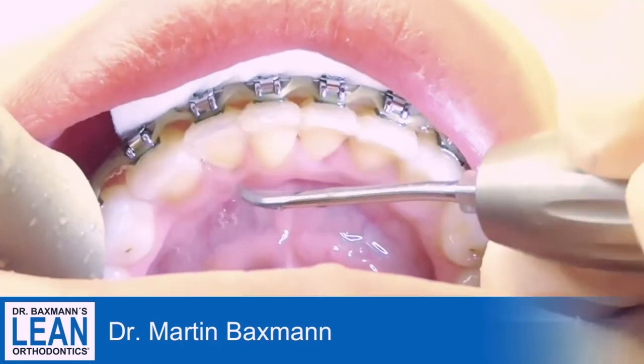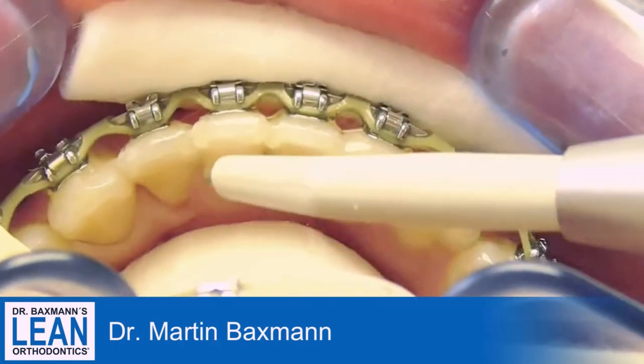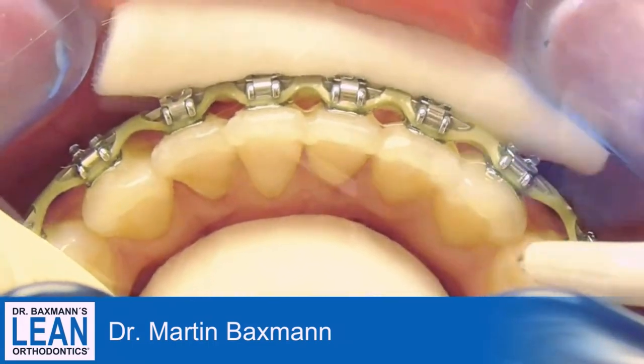The first tip that you can see here right away is that we place the retainer before we actually remove the fixed appliance.